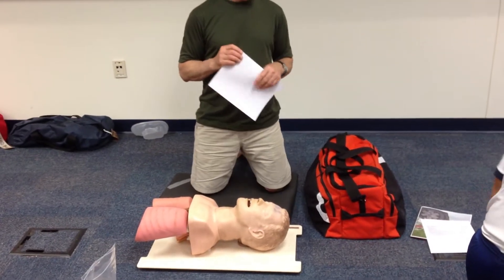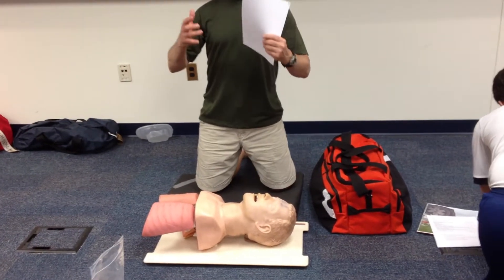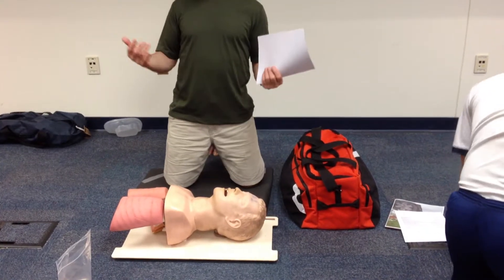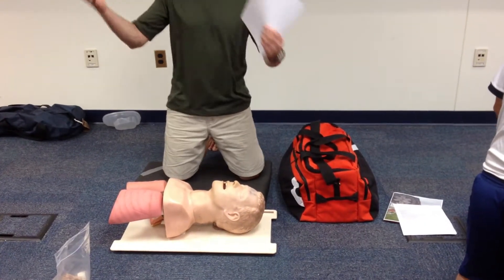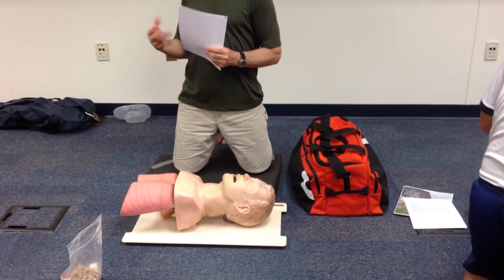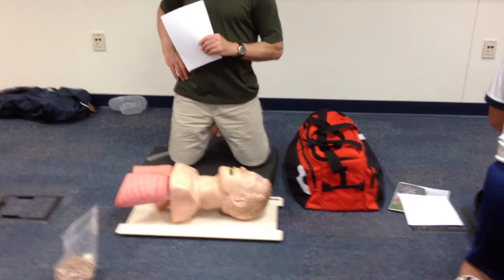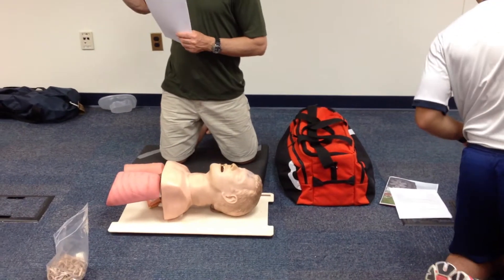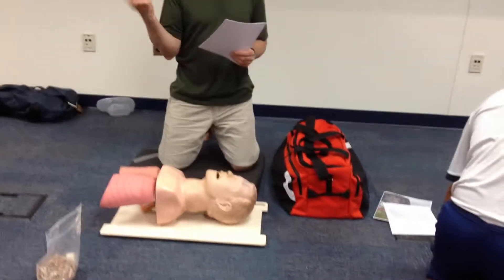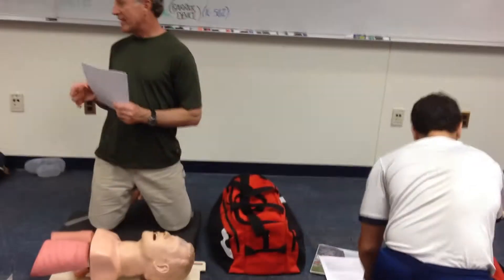We have the regulator off the oxygen cylinder. In real life, you would have done your checkouts in the morning or when you first come on shift and would leave your oxygen cylinder assembled. But for testing, we're going to have the regulator off as if you're just coming on duty. When we take the regulator off, we shouldn't have to untwist the T-handle so much that it actually comes on. Lay it back down in your bag and set the regulator in next to it.